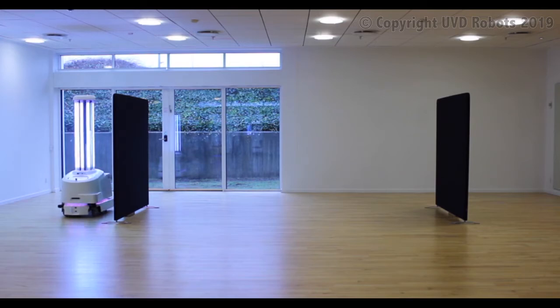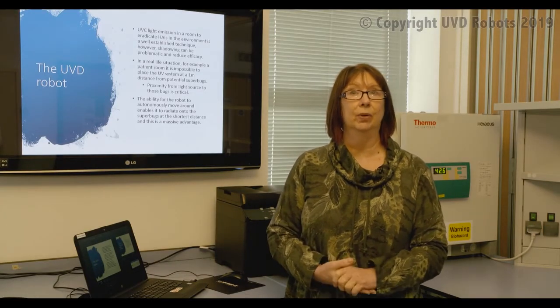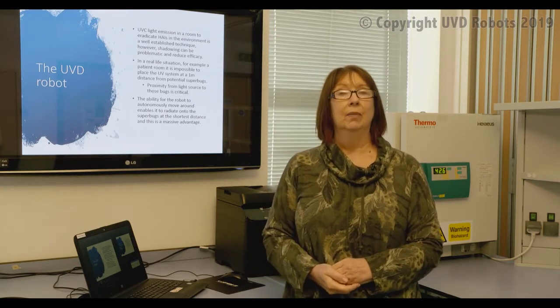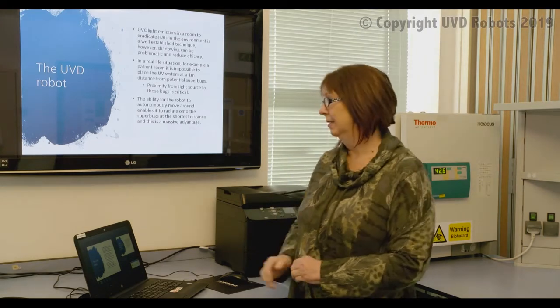And the tests that have been done in the laboratory, and certainly in our study, were done within a 1 metre proximity, and that's very important. A greater distance that the UV light has to travel, the less kill you get.